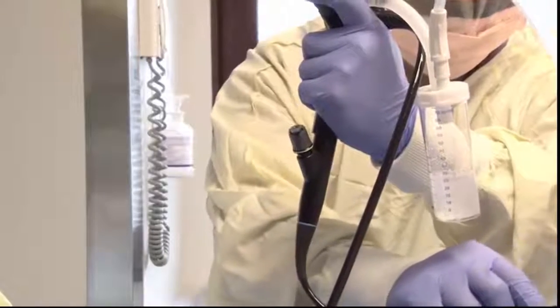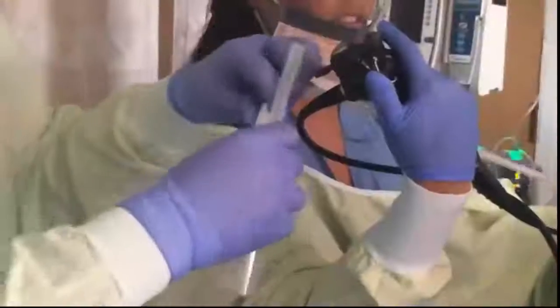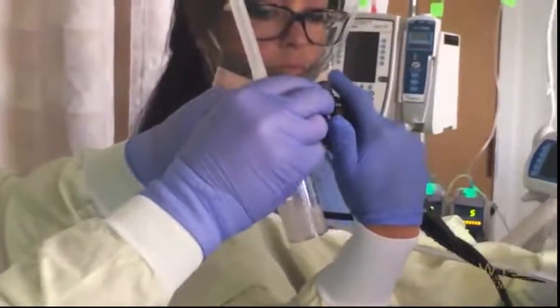Once an adequate volume of aspirated lavage fluid is collected, the BAL procedure is terminated. Generally, 10 to 25 milliliters of lavage volume is sufficient for routine bacterial and fungal cultures. However, larger volumes may be required depending upon the specific tests to be run.